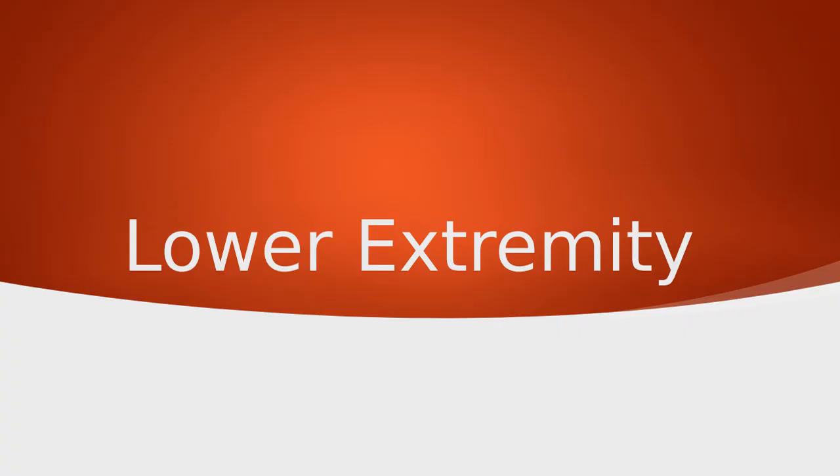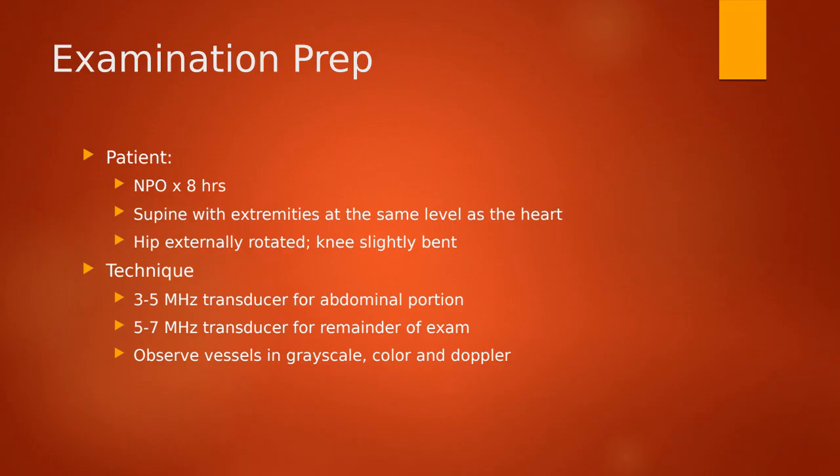So moving into lower extremity. Those grafts, again, like we said, we're usually going to be using a bypass graft for patients who are really sick, so cancer patients, dialysis patients. We're using a lot of arm evaluation for bypass grafts, but we're definitely still using those in situ bypass grafts or the synthetic bypass grafts down in the patient's arterial legs.